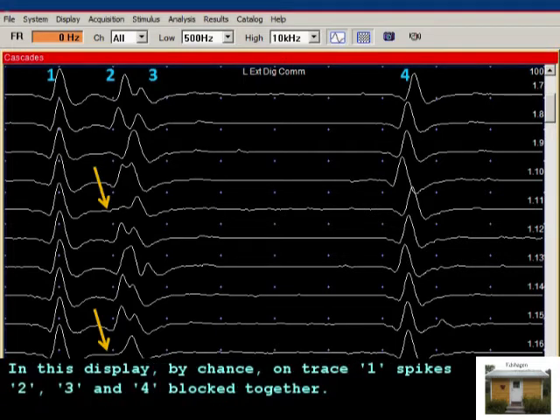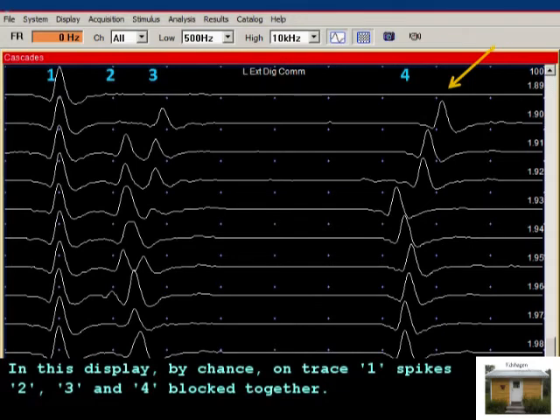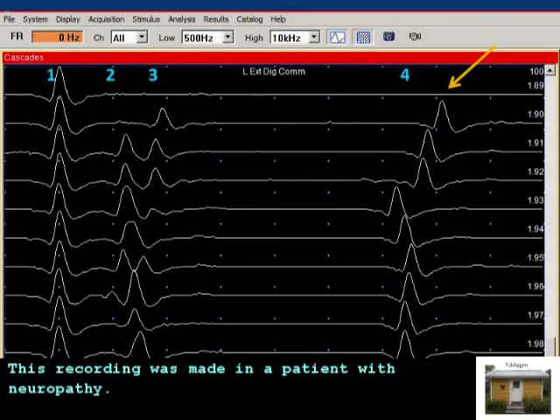In this display, by chance, spikes 2, 3, and 4 block together. This recording was made in a patient with neuropathy.